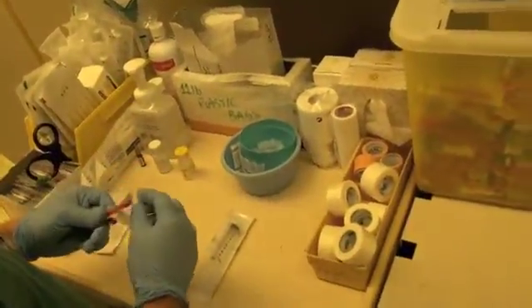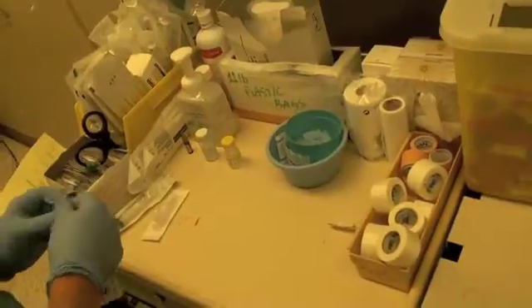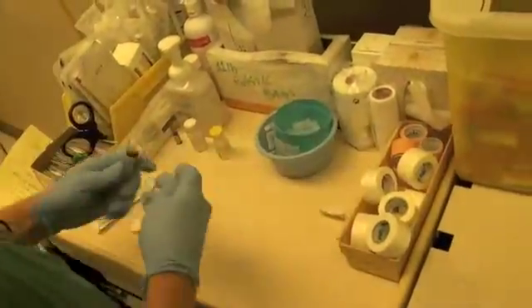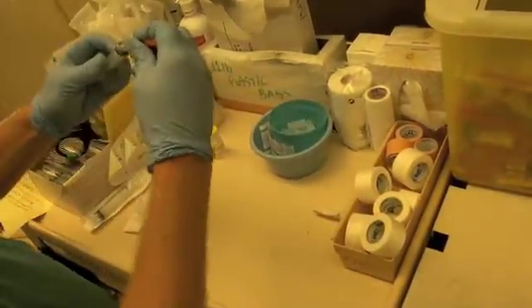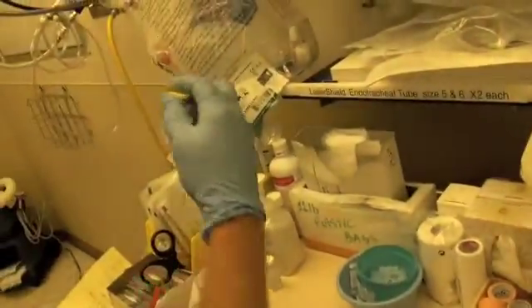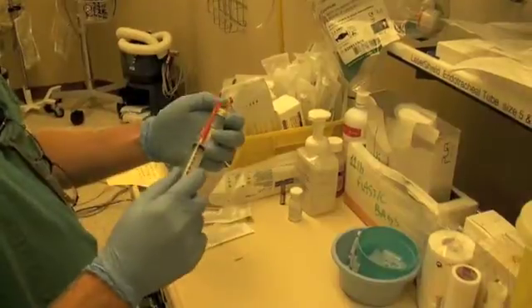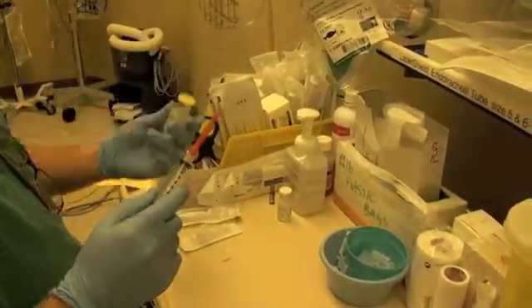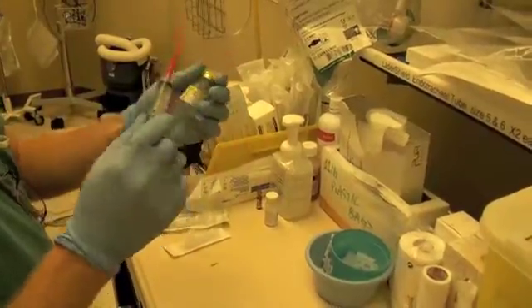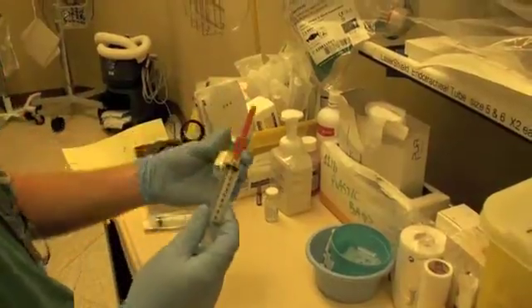Attach the needle to the syringe. In this case these are single-use vials, which almost everything is. In order to easily get 10 milliliters out of this vial into the syringe, we're going to inject 10 milliliters of air to replace the 10 milliliters of fluid that we're going to be drawing out.